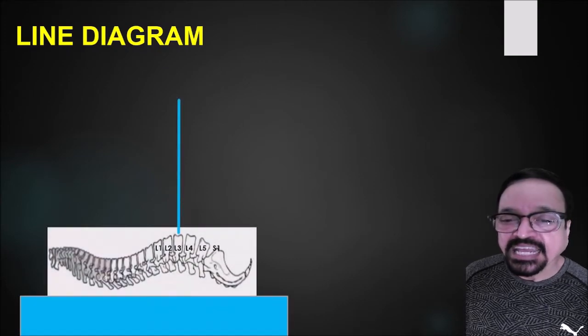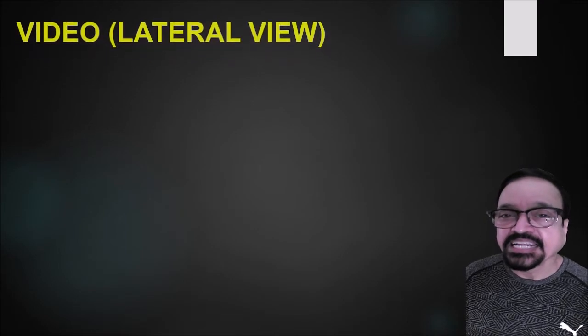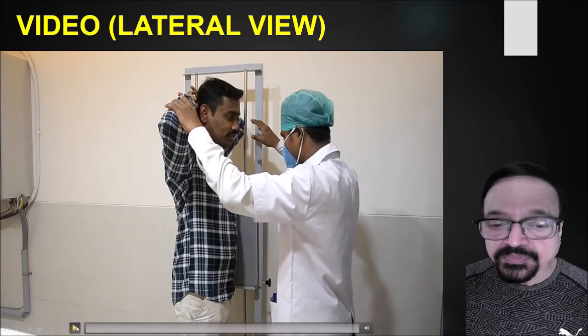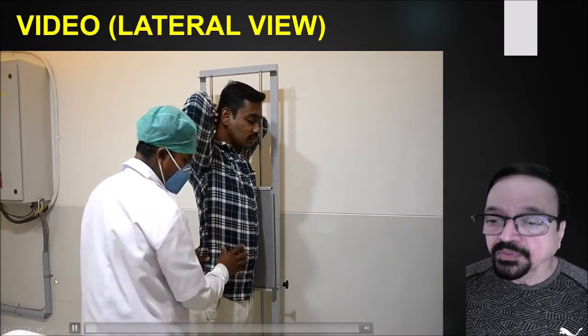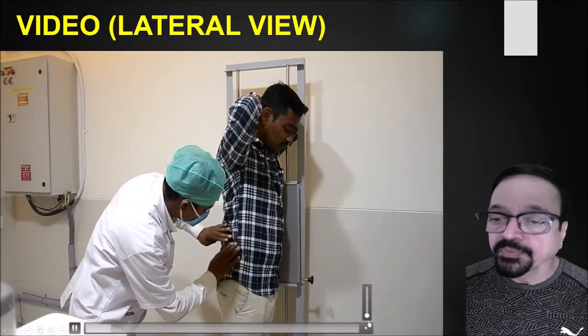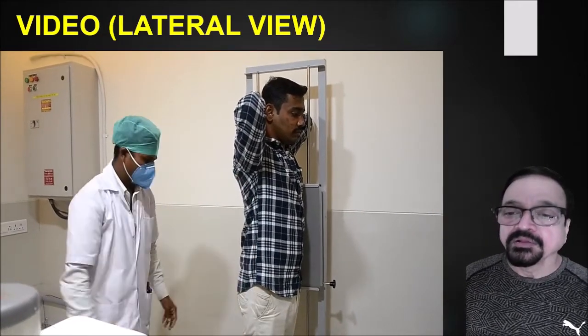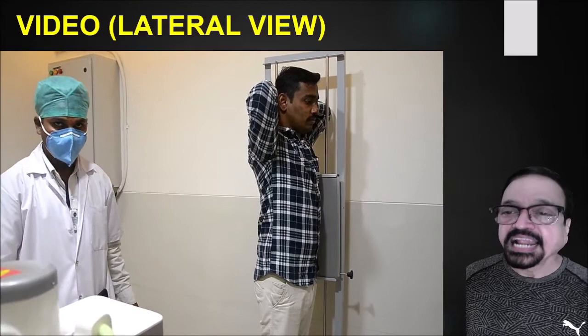Now here you are seeing how a lateral projection looks like and where they are centered. Now let's go to the video. Perfectly lateral position patient.